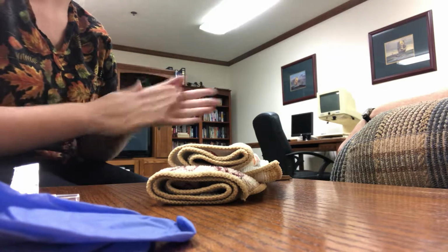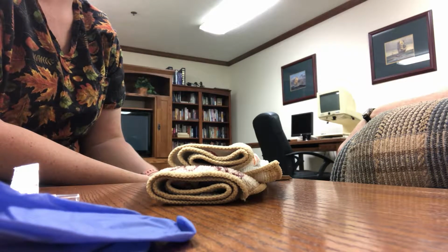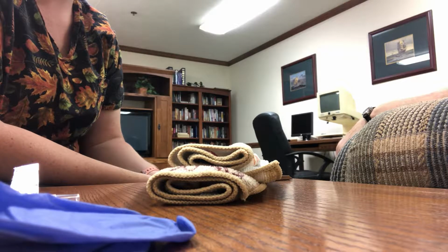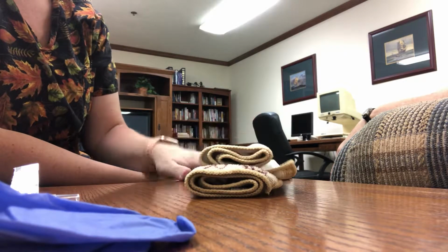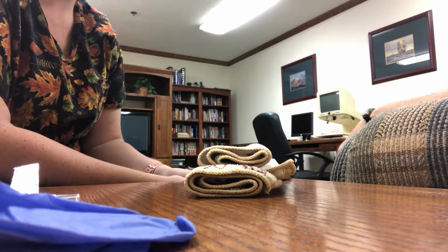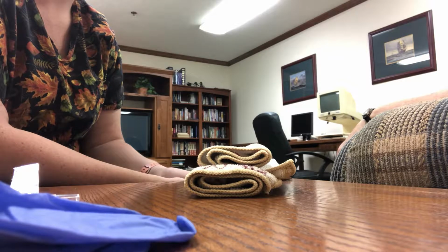Good morning, Mrs. Robinette. I'm Tori, and I'm with the Respiratory Care Department, and I'm here today because your doctor has an order for us to draw your arterial blood gas. Okay. So what that means is that I'm going to be drawing blood from your arteries instead of your veins, which is what you've had done previously during your stay here at the hospital.